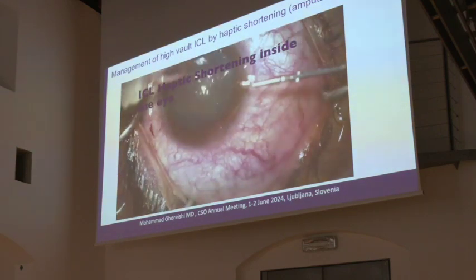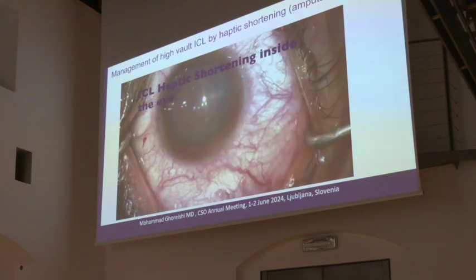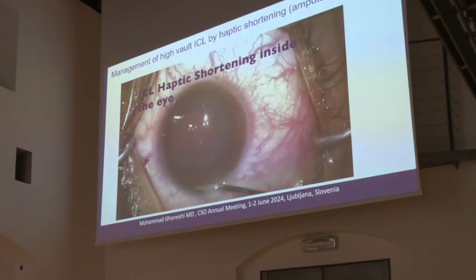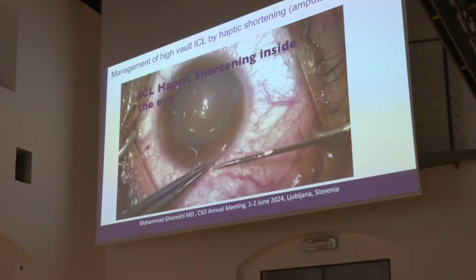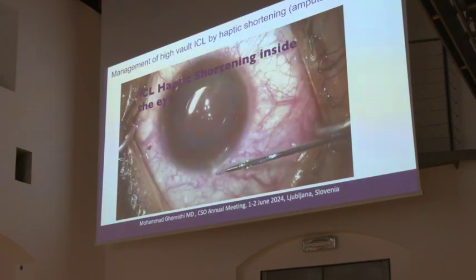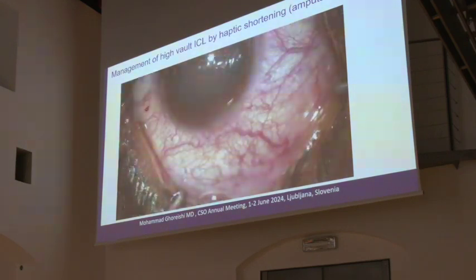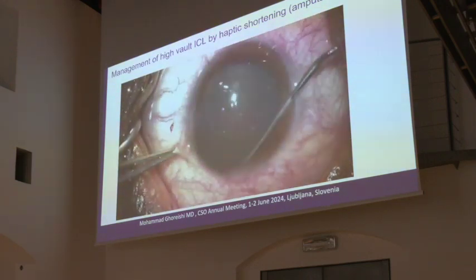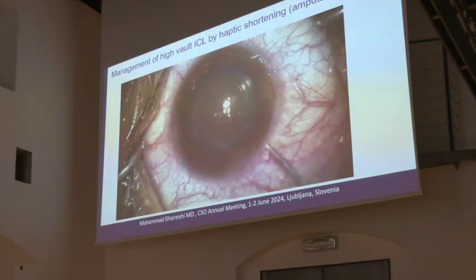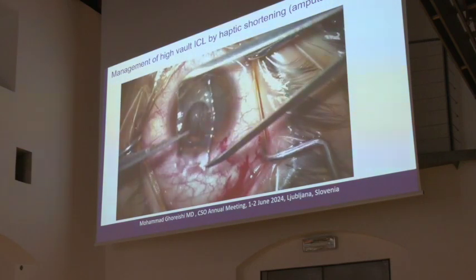In the first case, I had significant cell loss, but in the other cases, it is based on your experience. Exchange will also have the same amount of loss. I did a cell count in every patient. In the first case I had more cell loss, but with experience, in the other cases I didn't have much cell loss. I don't recommend it to other people; you have to be very, very careful with this operation. For me, my patients have to wait a long time, but that isn't the question.